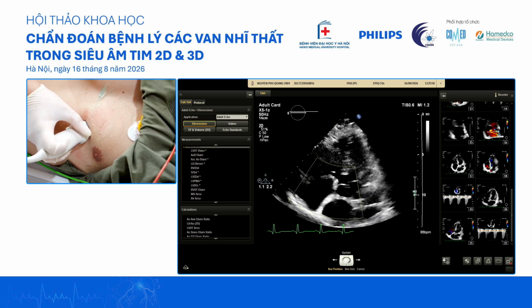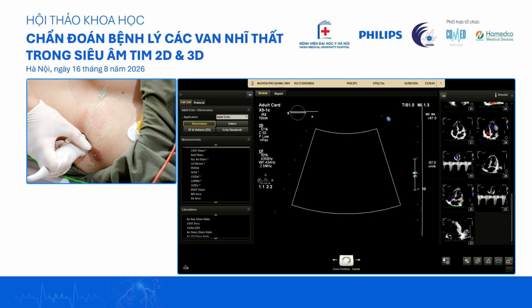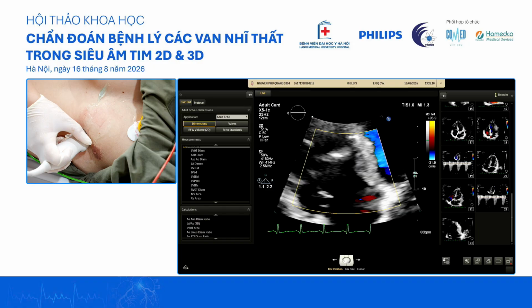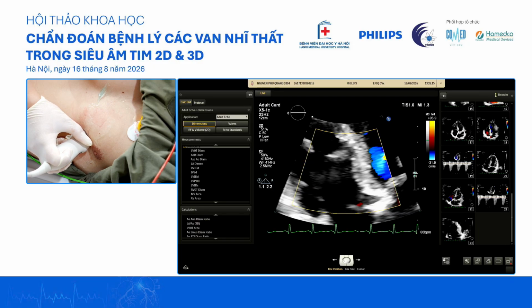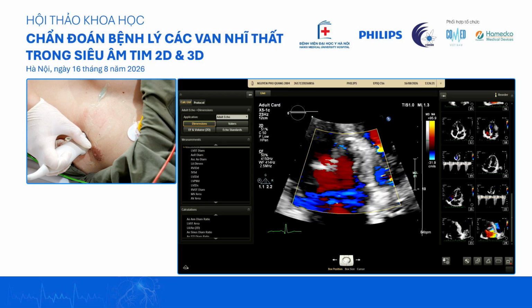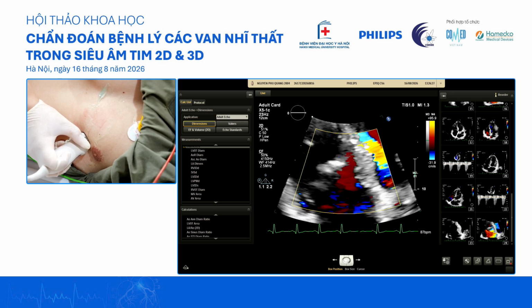If you want, you can also zoom in and try to acquire the PISA. Chúng ta zoom vào để đánh giá, tìm cầu hội tụ. You might need some angulation in order to get the PISA head to come out, because we know that the 2D is only one plane, so you only see maybe two leaflets, but the regurgitation might be coming from the other leaflet too.